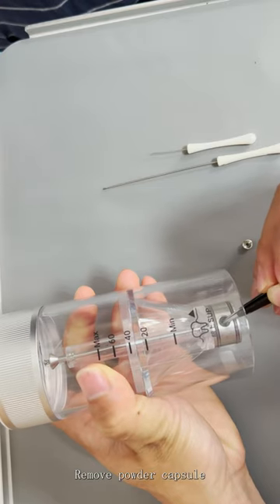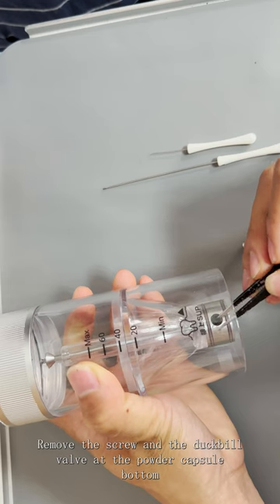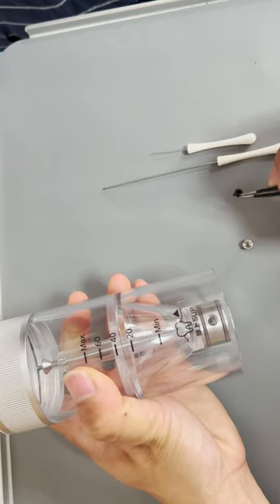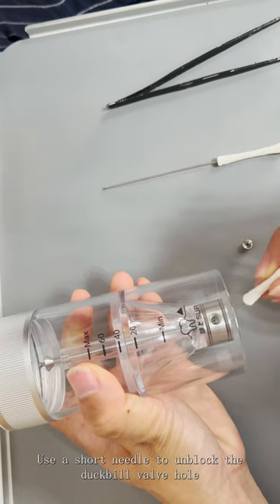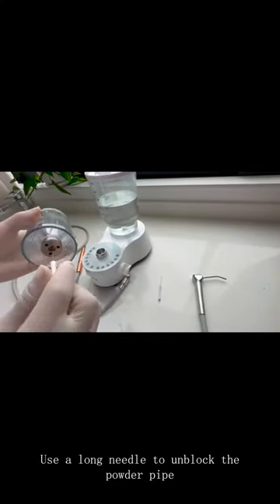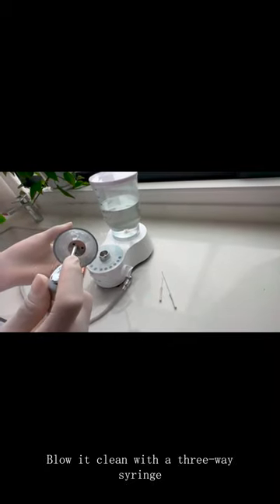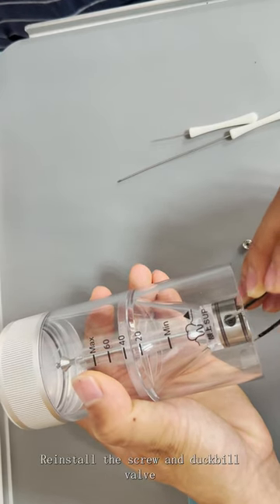Remove the powder capsule. Remove the screw and duck-bill valve at the powder capsule bottom. Use a short needle to unblock the duck-bill valve hole, and a long needle to unblock the powder pipe. Blow it clean with a three-way syringe. Reinstall the screw and duck-bill valve.